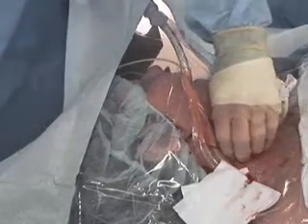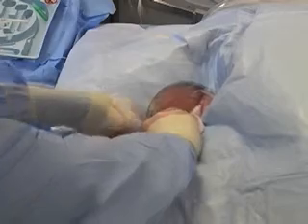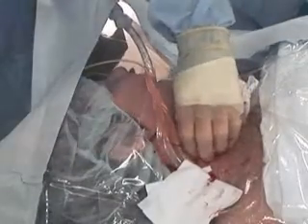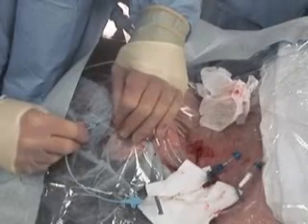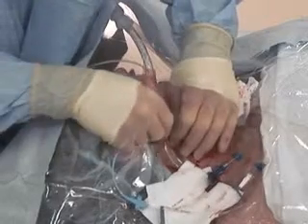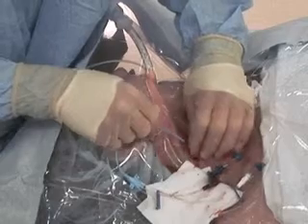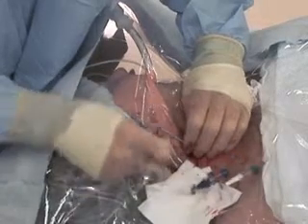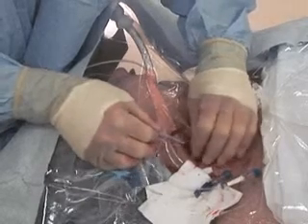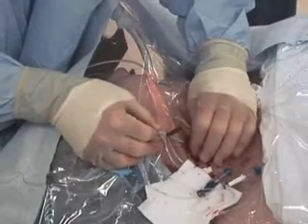Remove the dilator, anticipating increased bleeding. Maintain a grasp on the wire. A 4x4 gauze pad can be applied to the insertion site to minimize blood loss. Once again, only the wire remains in place. Now, feed the catheter over the guide wire, being certain to maintain control of the external end of the wire before advancing the catheter through the skin. This usually requires that the wire be pulled slightly out of the patient until the external end of the wire extends out of the catheter hub and can be grasped.